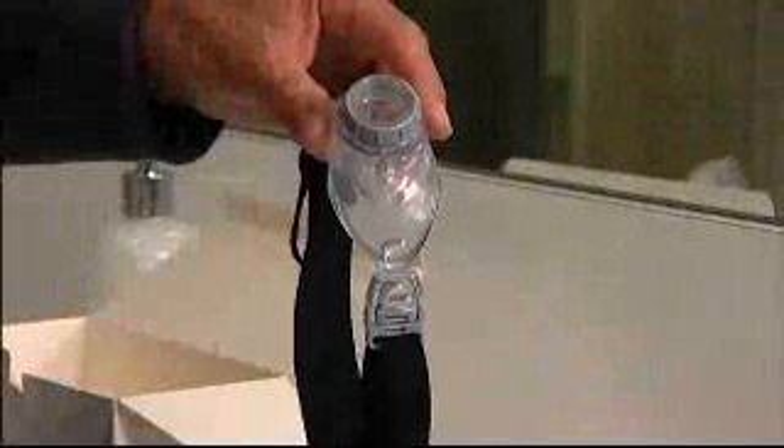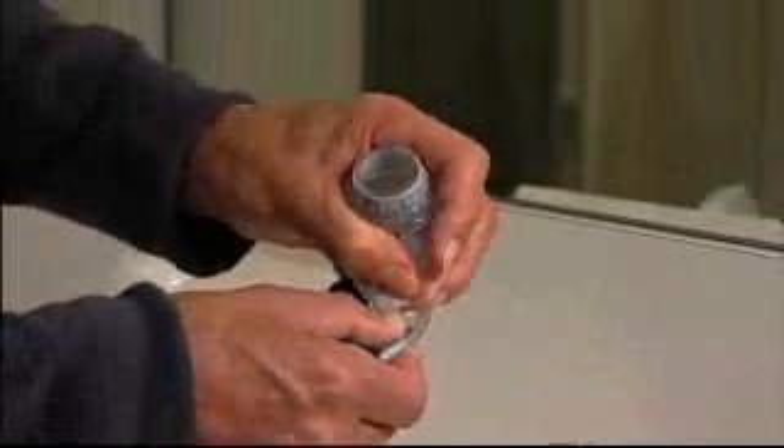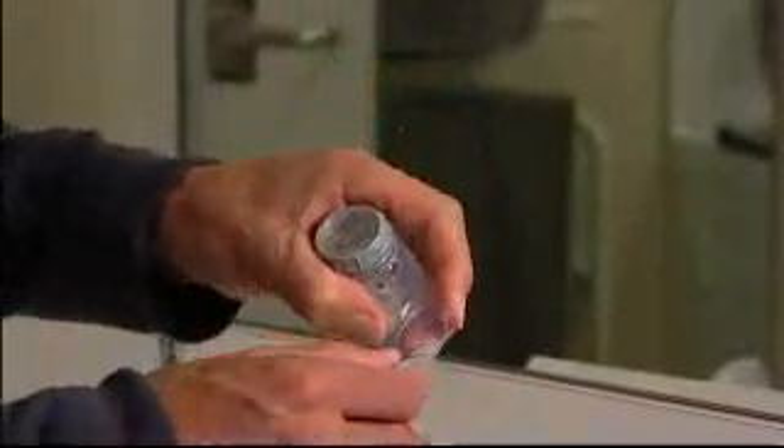It is recommended you use the headgear with your oracle for optimum comfort and a secure fit. However, if preferred, it is optional to use the oracle without headgear. To do so, simply remove by unhooking both clips from the snap flap cover.